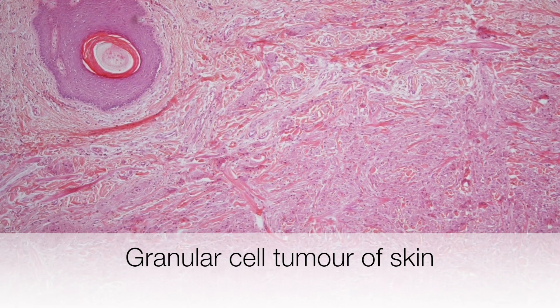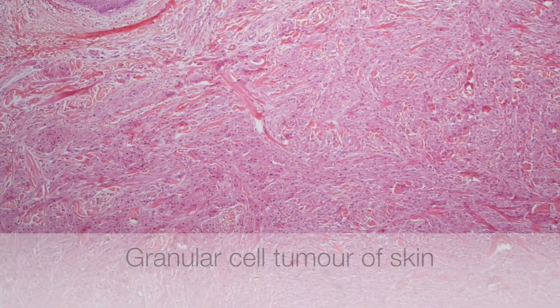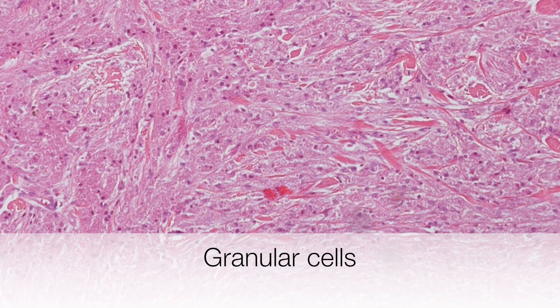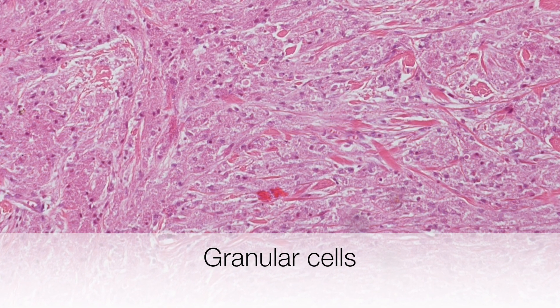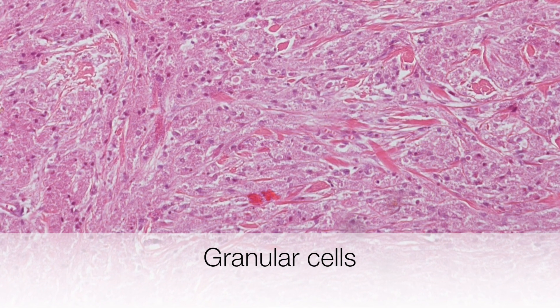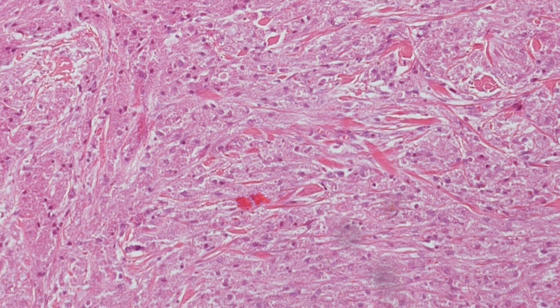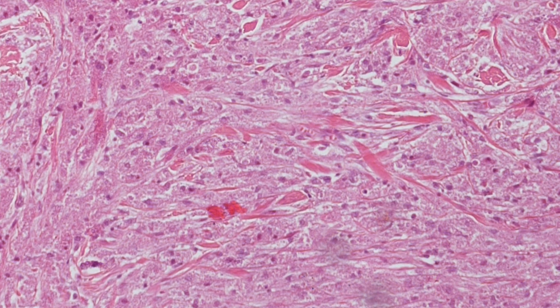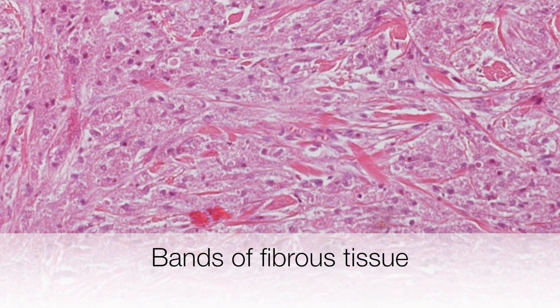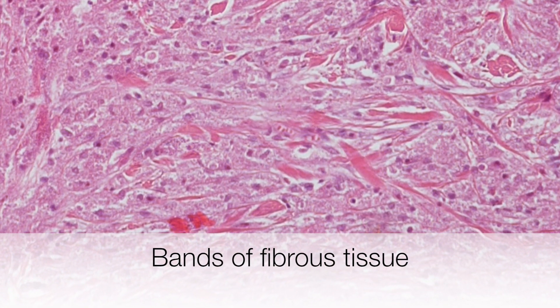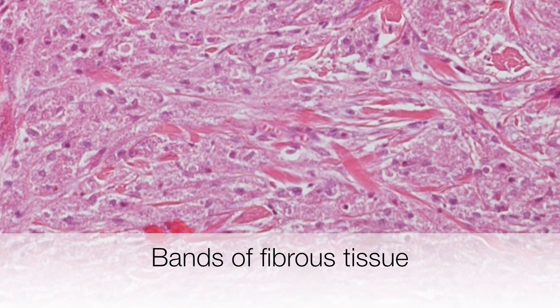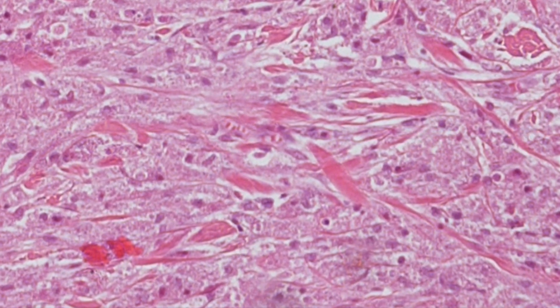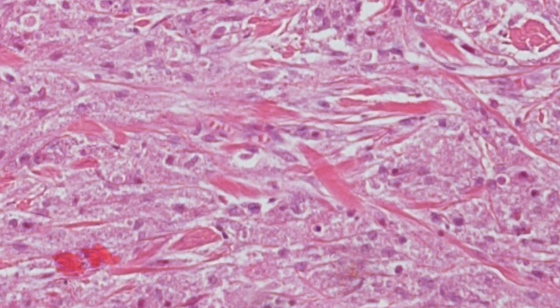This is a granular cell tumour arising in the skin. At higher magnification, the granular nature of the cytoplasm is revealed, and between the granular cells there are streaks of dark pink staining tissue — these are bands of fibrous tissue, typical of the fibrous stroma of granular cell tumours. This is why on palpation granular cell tumours feel hard.